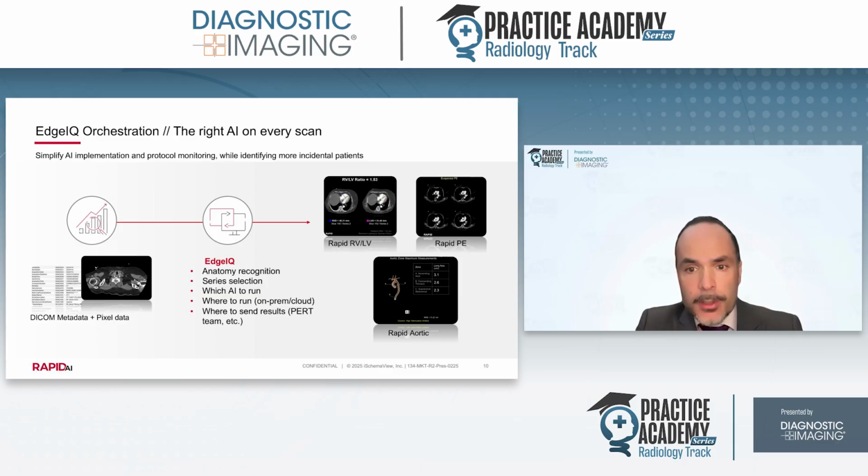Downstream benefits also include that any scan that may have a potential finding of interest is going to be processed, but only such scans are going to be processed. You don't have to cast an overly wide net, I should say. You can really customize the linkage between exam type, finding of interest and the model that you think is best suited to that kind of analysis.